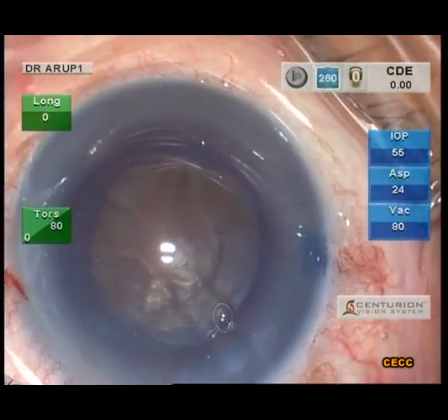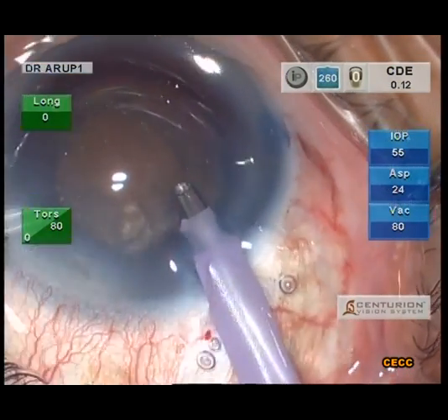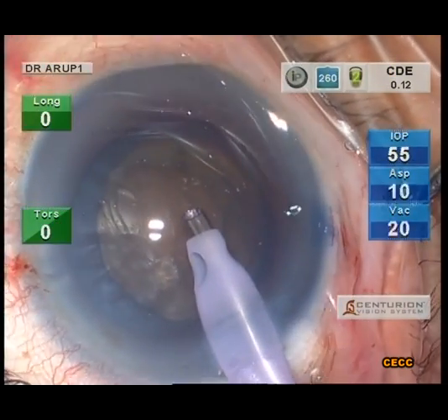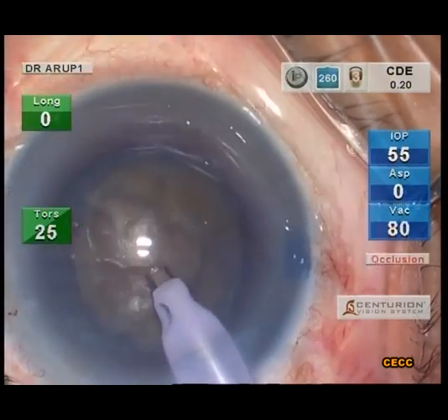Before proceeding with trenching or chopping, it is useful to clean up the superficial lens matter as well as the OVD in front of the nucleus. A few OVDs like Viscoat are thermogenic and can result in wound burns.